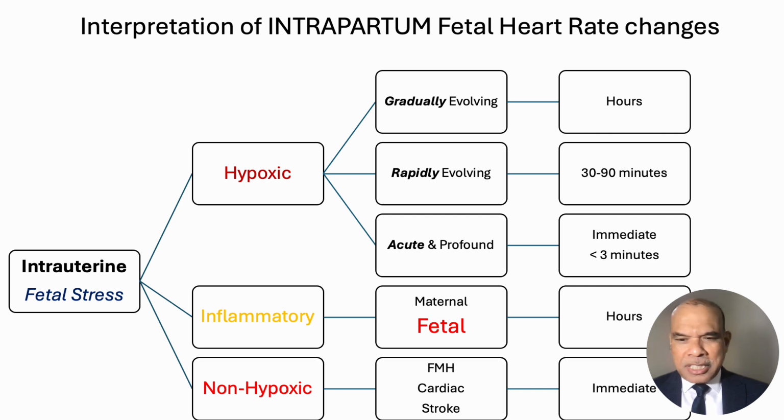We cannot use normal, suspicious, pathological, because when you say suspicious, if you ask honestly an obstetrician or midwife who calls a CTG suspicious, if they have probity and honesty, they would say, we don't know. That's why we are suspecting something. Whereas we cannot allow that to happen when you do physiological interpretation of CTG. We have a responsibility. Just like cardiologists looking at an ECG, they have a responsibility to make a diagnosis.